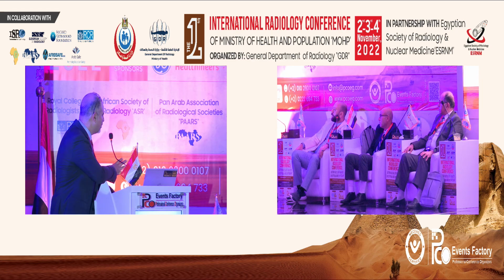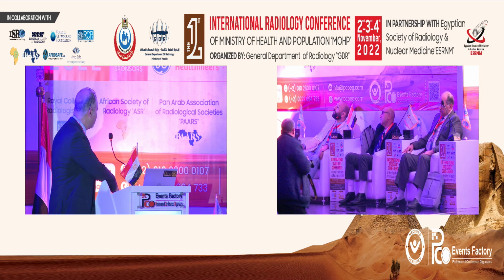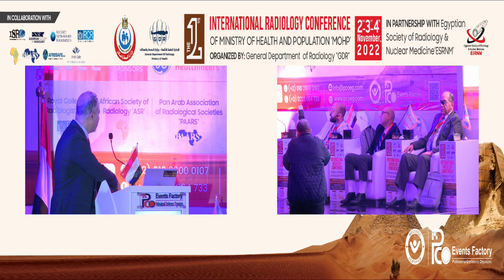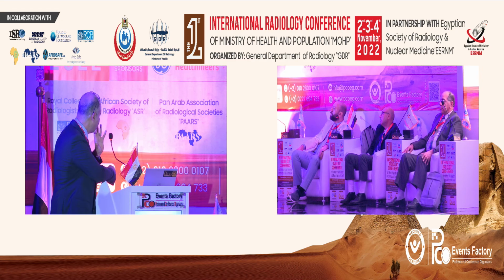Yeah, changing the upright position. If you change the patient, like we do in the lower limbs, you usually examine the patient in a supine position, and you do this. You rarely find the reflux or very small reflux. When you examine him in the upright, sitting position, you will find absolute reflux.